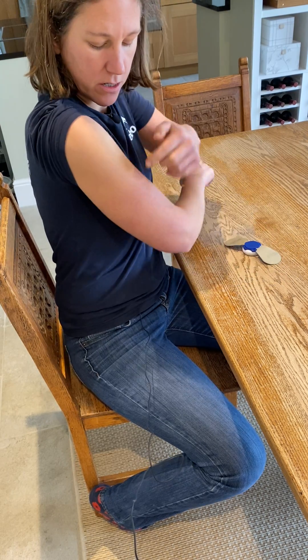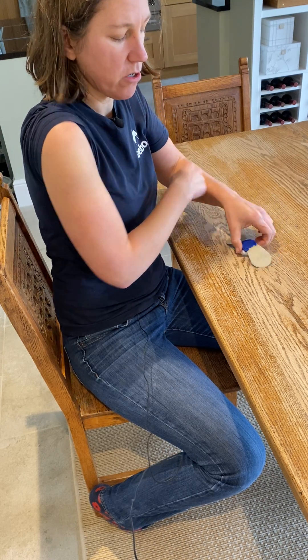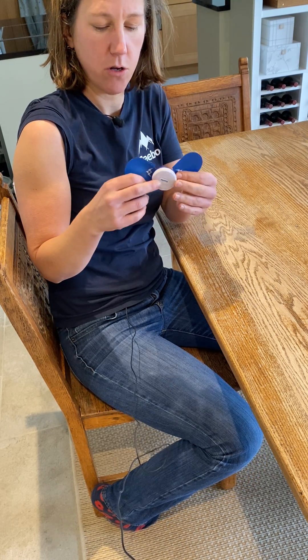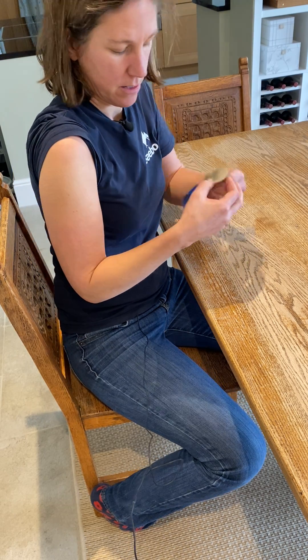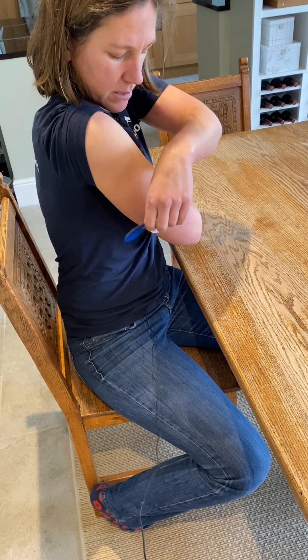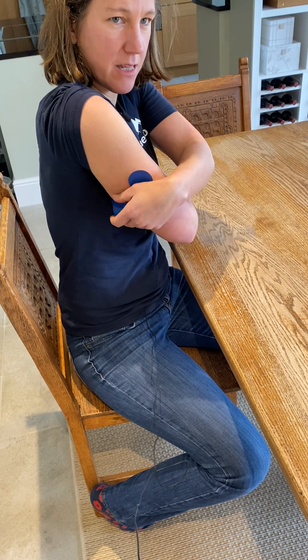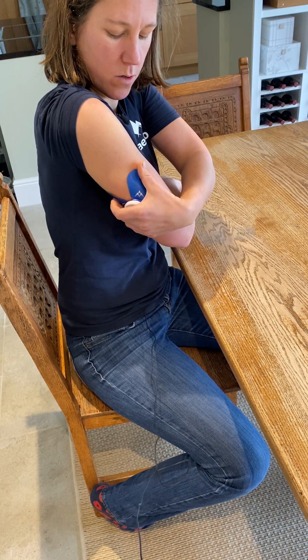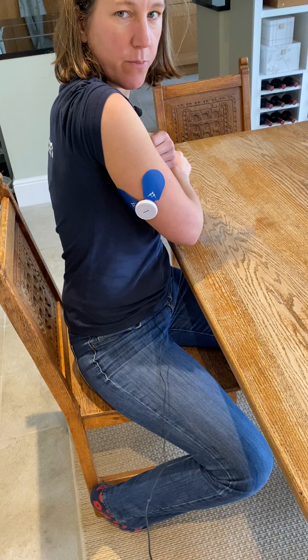For elbow extension I want to get it on the triceps. This time you've got two different options: you can form the wings into a v-shape and stick them on the back of the upper arm. I would suggest this if you have got quite a bulky arm and you've got the width to do this on the upper arm.